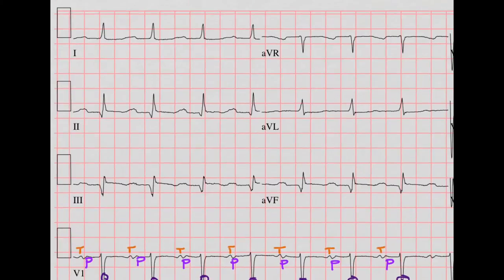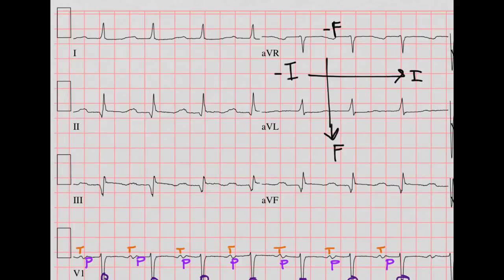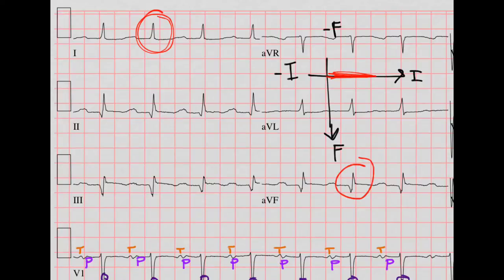Next, let's look at axis. We can see that lead 1 is mostly positive, and that F is also mostly positive. So we're in this quadrant, so we've got a normal axis.